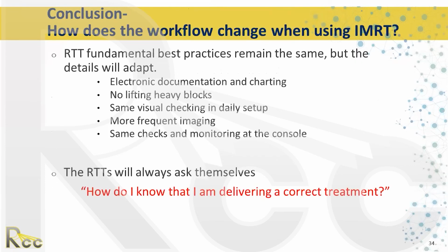Okay, so in conclusion, how does the workflow change when using IMRT? For RTTs, electronic documentation will be implemented, so we won't be manually entering in the plan parameters, but every day we will still be making sure that we're on the correct plan, you have the correct fraction, and you're going to make sure that all your numbers match the printed out PDF of the plan.